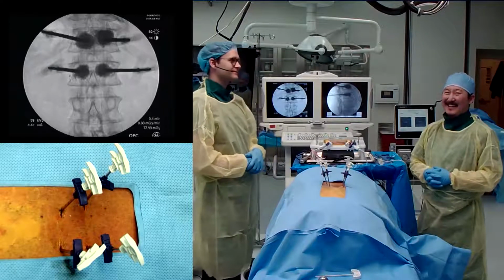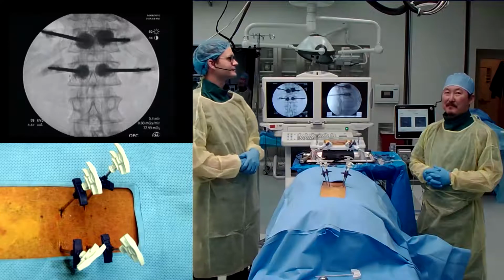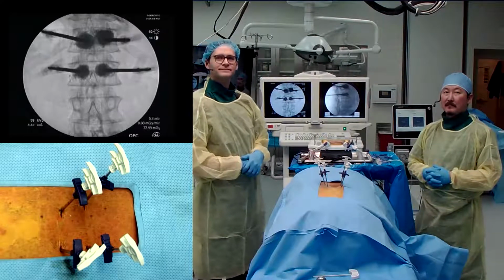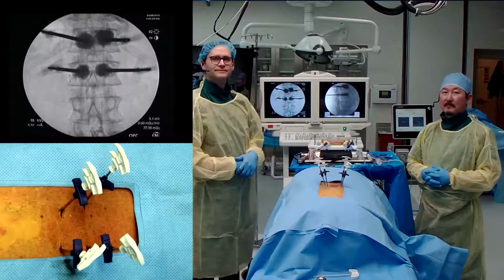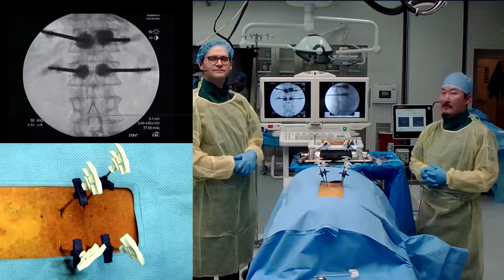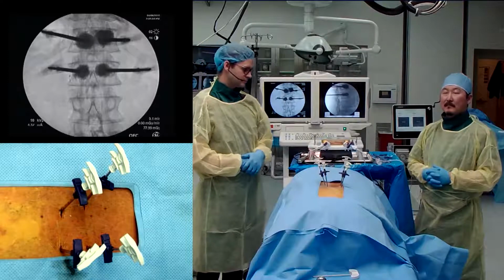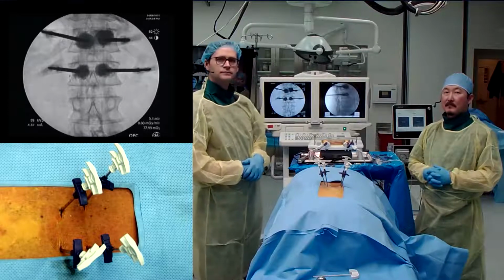If you reach the medial wall and you're only halfway down the pedicle, you're still in canal territory, and you have to reposition the needle, because there are incidences of injuring the nerve roots or even the cord by not paying attention to that medial wall.